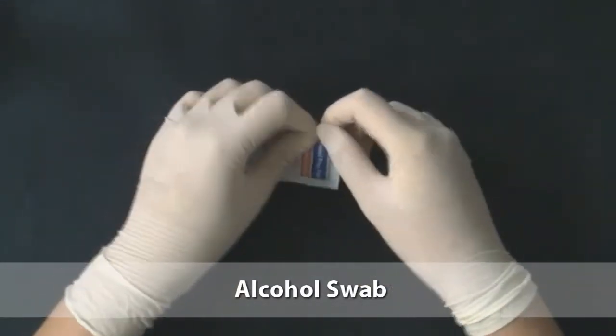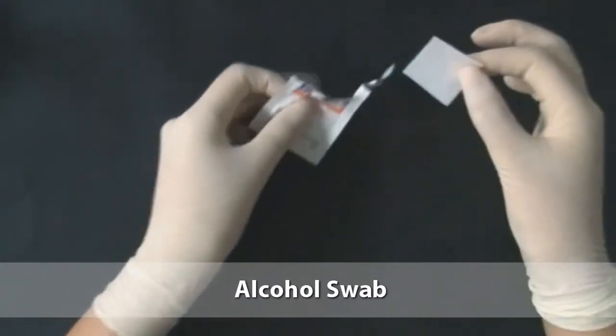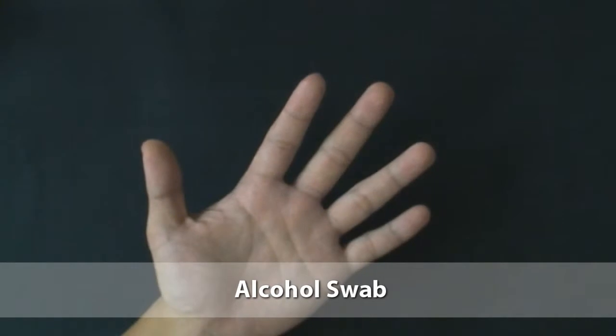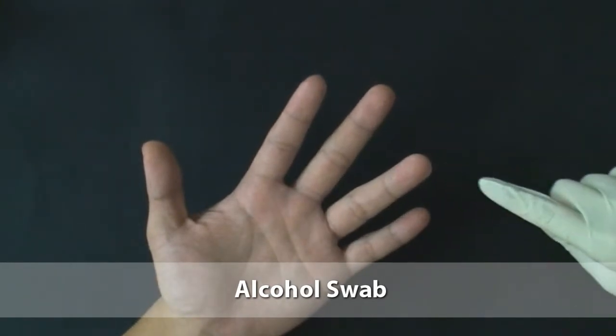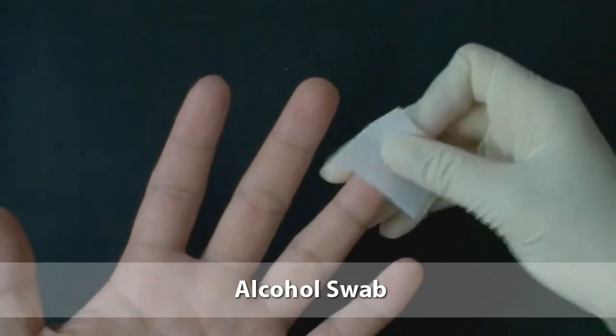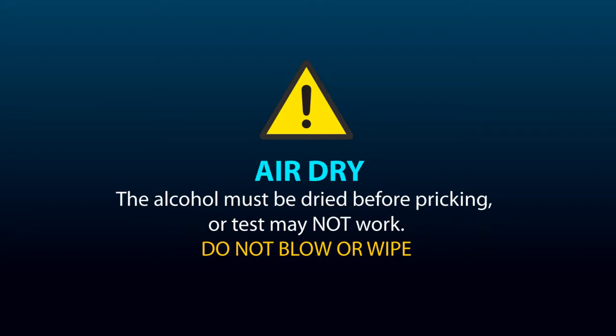Open the alcohol swab. Grasp the fourth finger of the patient's hand and clean the patient's finger with alcohol swab thoroughly. After cleaning the finger, it must be allowed to air dry. Remember, the alcohol must be dried before pricking, or the test may not work. Do not blow or wipe the finger when you dry.